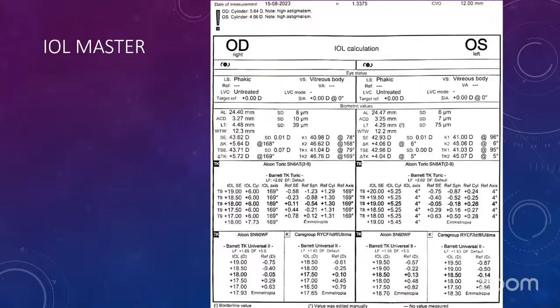No, customized IOLs are lathe cut IOLs, so you don't get hydrophobic IOLs easily. Few hydrophobic IOLs are cast molded, so you would have to have a cast for that IOL power, which is not possible for a customized IOL. Most customized IOLs are hydrophilic because they are easy to lathe and create. So we can have hydrophilic IOLs of any power. If you want, say, a 50 diopter IOL, it can be prepared in hydrophilic form.